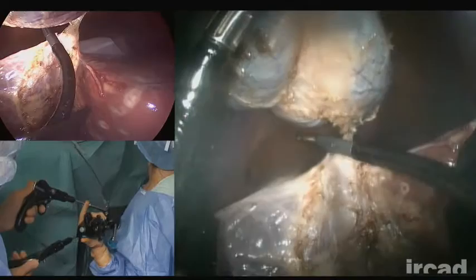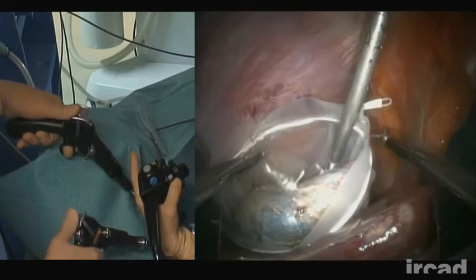The gallbladder was then dissected using the two-way articulation instruments and placed in a specimen retrieval bag prior to removal through the vagina. The operative field was examined for hemostasis and any inadvertent organ injury was ruled out. Cholecystectomy was successfully accomplished in 60 minutes using the Anubiscope.